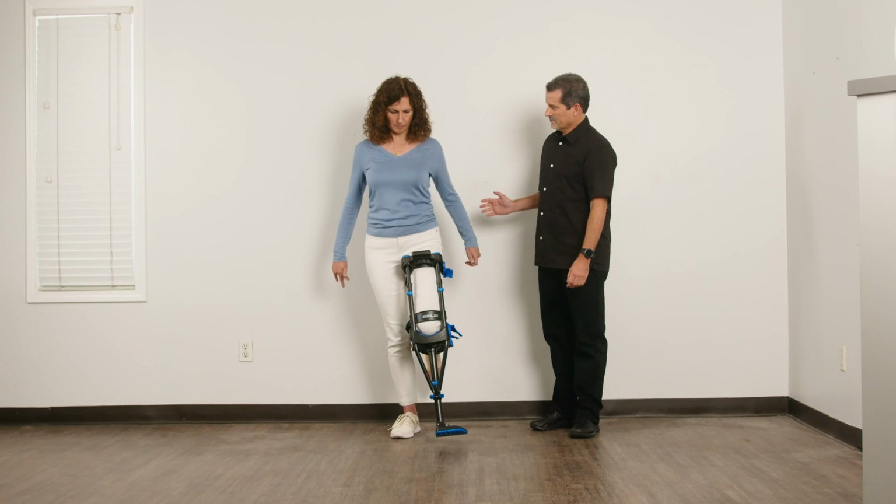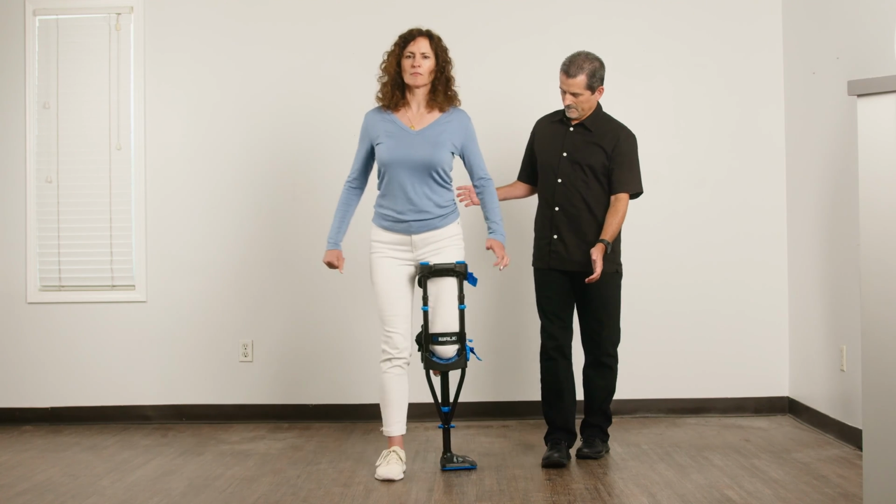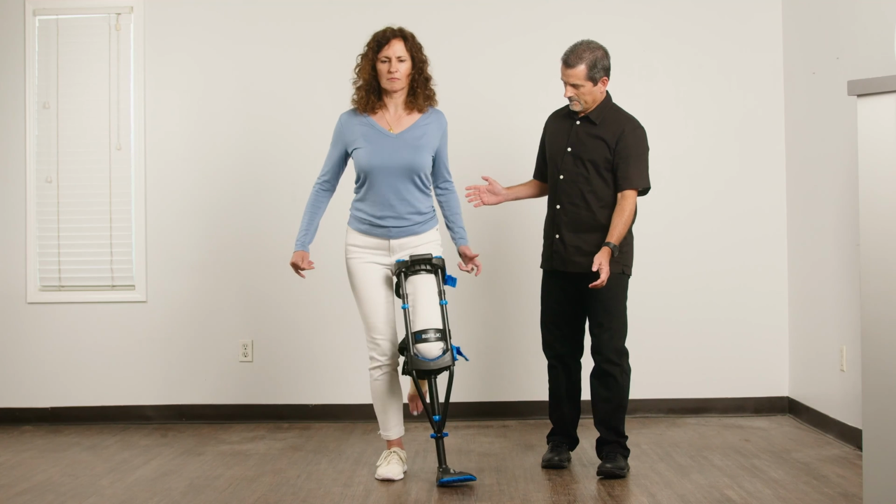Assistance from others. If your patient has a companion or caregiver who wants to assist, don't let them. Having an inexperienced person involved in the training process will only distract the patient and inhibit the learning process.